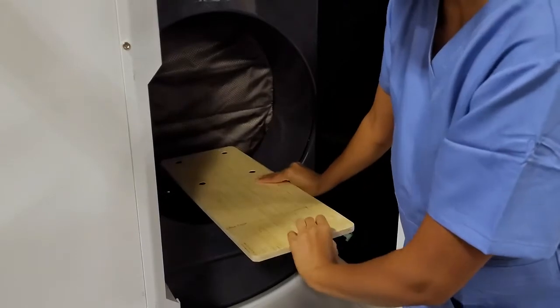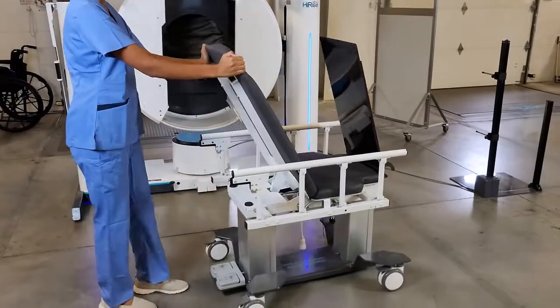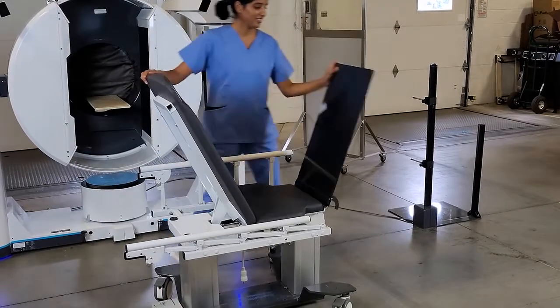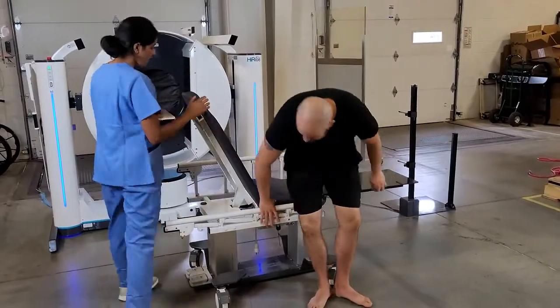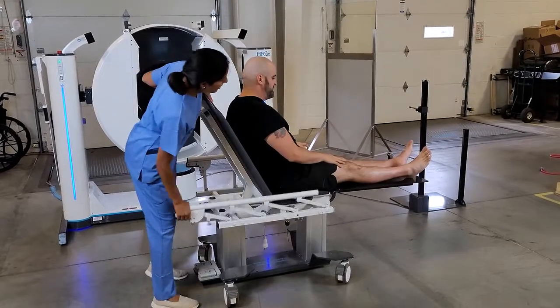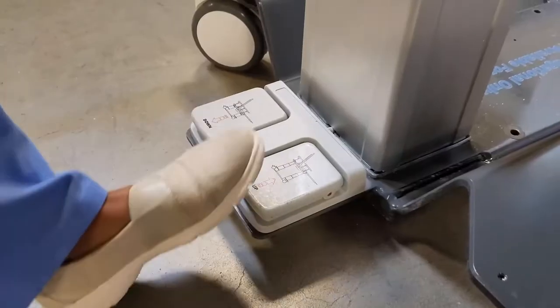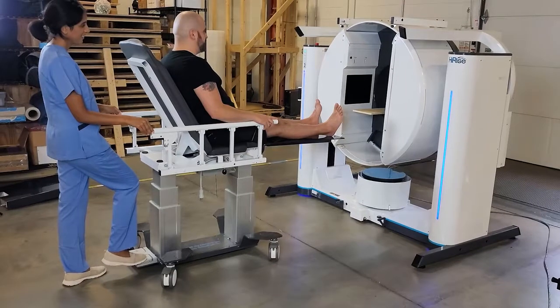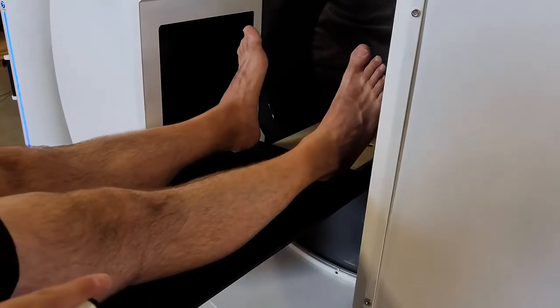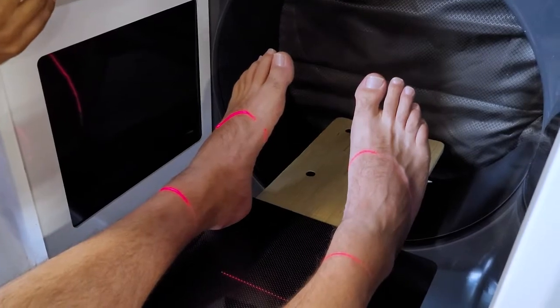Non-weight-bearing scans of the knees and feet are performed with an accessory chair that supports up to 450 pounds. The accessory chair is included with the HiRISE. The patient sits on the chair at ground level, which is then raised via an automated foot pedal to gantry height. Lasers ensure correct positioning.